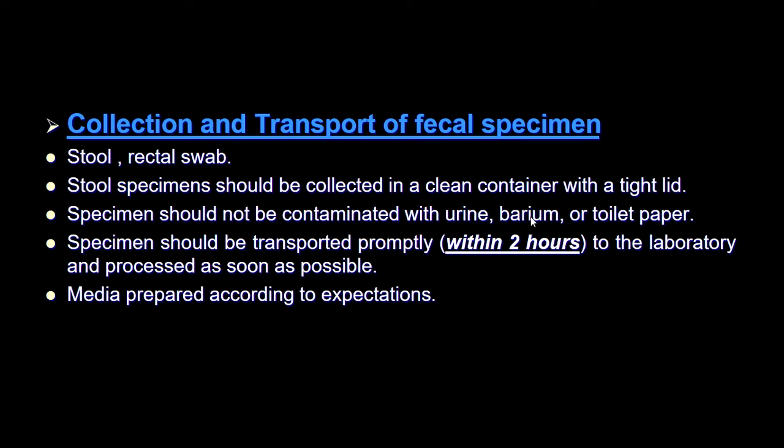They use barium enema or barium meal, so it should be washed and should not be contaminated, sorry, with barium, because it could give you a false positive. You could be mistaken with other microorganisms. So very, very important to remember that you should not have any barium in the specimen.